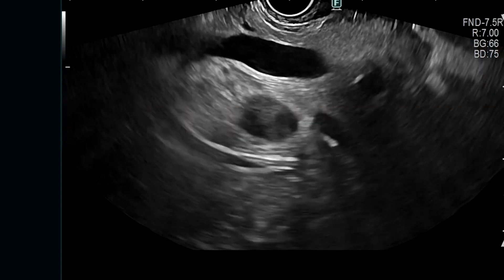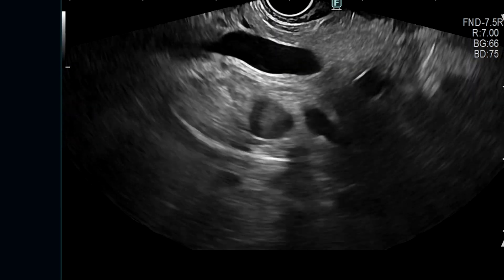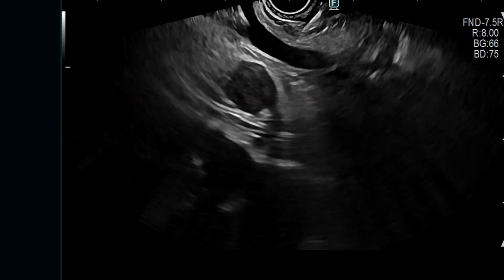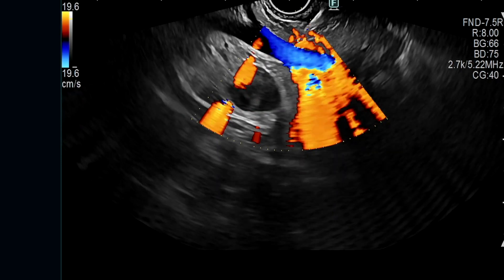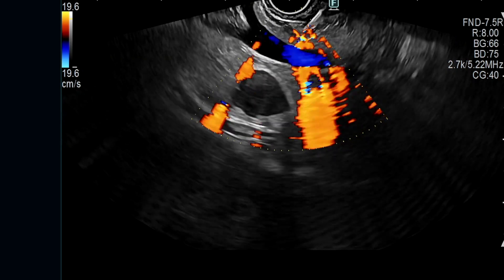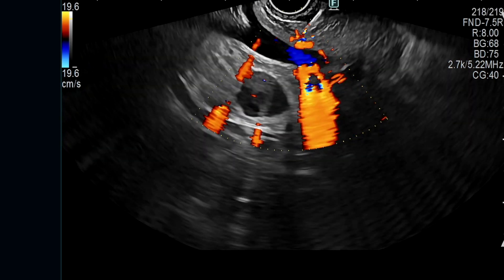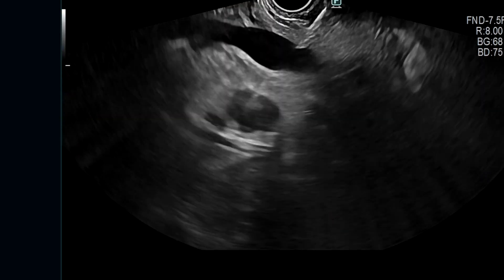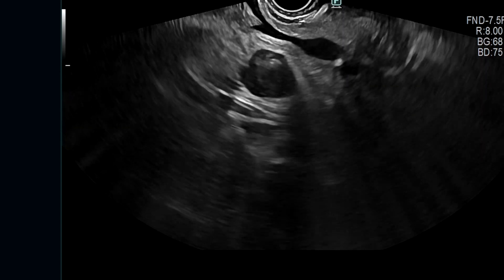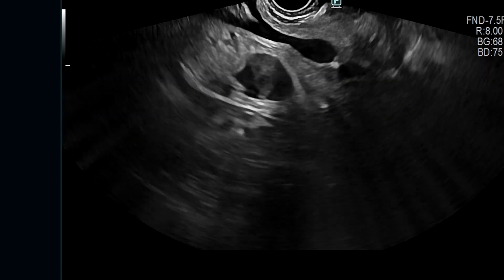This 57-year-old female with abdominal pain presented with a 15mm-sized mass in the pancreatic neck region, noted on CT scan. At EUS, a 15mm solid mass was seen posterior to the portal vein with no clear window for tissue acquisition. A 25 gauge XPECT FNA needle was positioned at the interface between the stomach wall and the portal vein, ensuring minimal distance between the target and the needle.